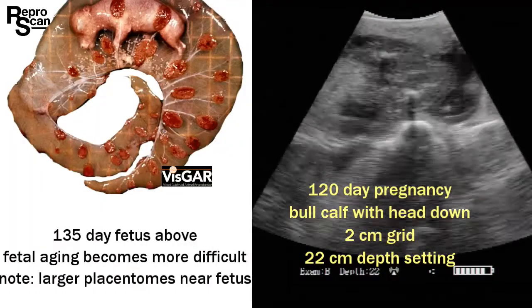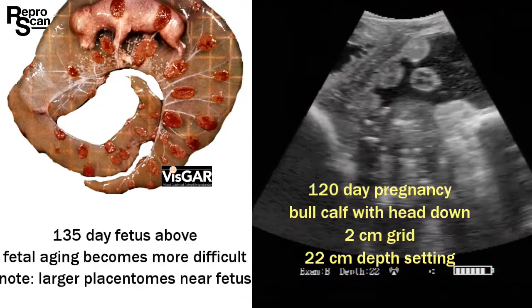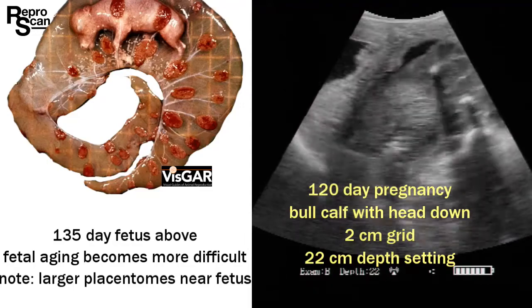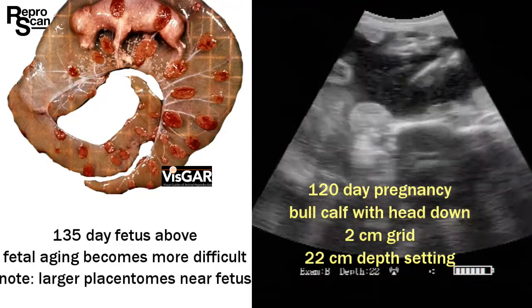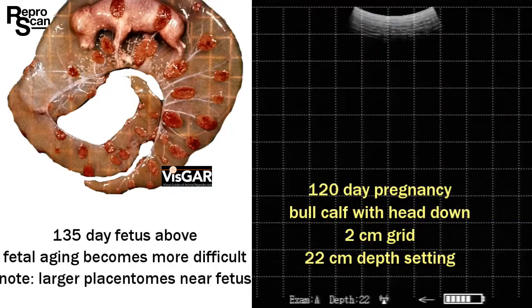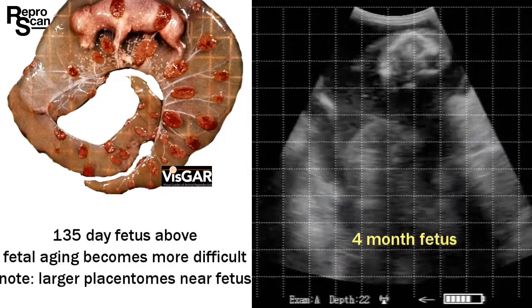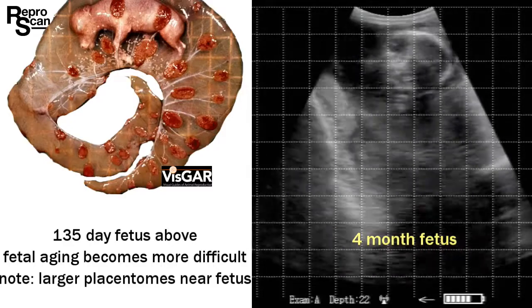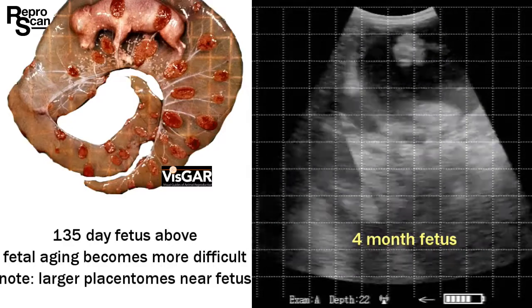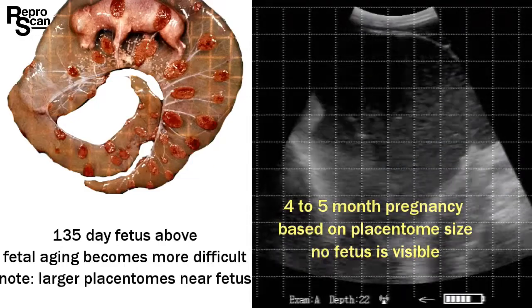On to the 4-month category, 120-day pregnancy on the right. If you're new to fetal gender determination, here's an easy one. You can see the scrotum between the hind legs there. And you can also see on the dissection, very distinct placentomes. Here's a head up, 4-month pregnancy. Again, we can get an estimated head diameter as it bobs around. It won't be that accurate, but we could go 4 months.